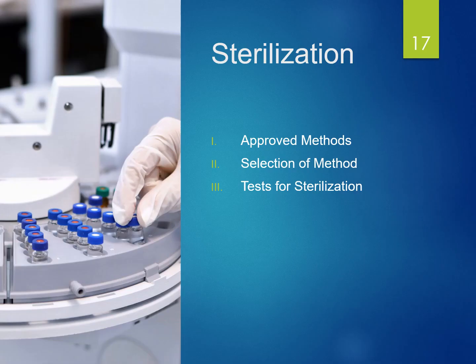Sterilization equipment is cleared through the U.S. Food and Drug Administration, and it is always used according to the manufacturer's specification. The different methods for sterilization can be steam under pressure, which is what we consider our autoclave. Dry heat, chemical vapor, immediate use sterilization are also known as flash sterilization. We have some cold sterilization, which is not recommended to be used for very many items, if at all. And all materials and items cannot be treated for the same method of sterilization.